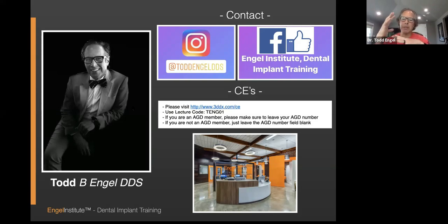So really quickly, if I place an implant and I see that I have an apical issue with the implant, I'm going to first decipher why. If it's a perforation, then what I'm about to tell you won't work. You have to reposition the implant, take the implant out, whatever it is. Once I've identified that the implant is indeed in the bony housing, like I showed you in the post-op scan, then I know, and excuse me, because I didn't even tell you why that happened. So thank you very much for the question. For all of you guys, the reason that happened, I would say 99% related to heat. So we want to make sure that we do continuous irrigation. My bad on that one.